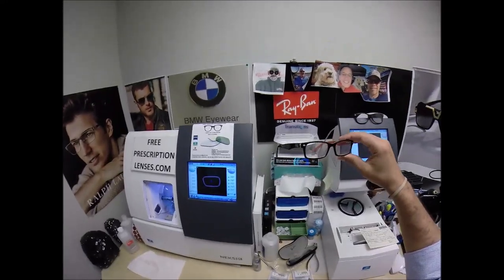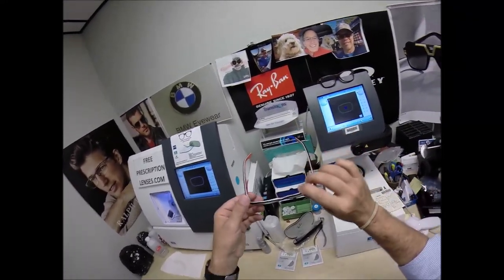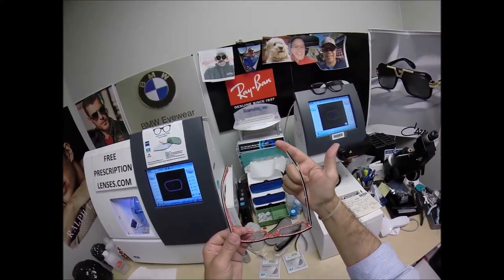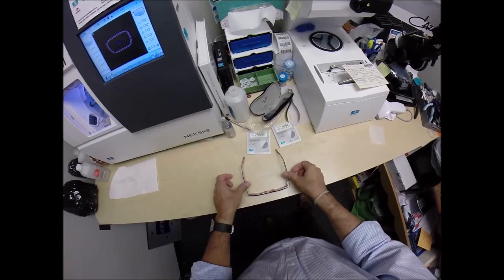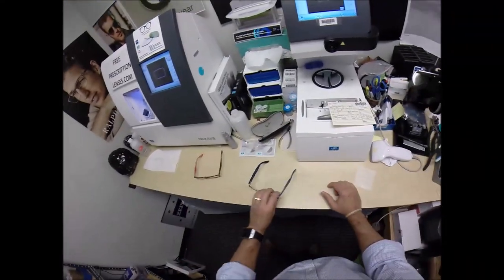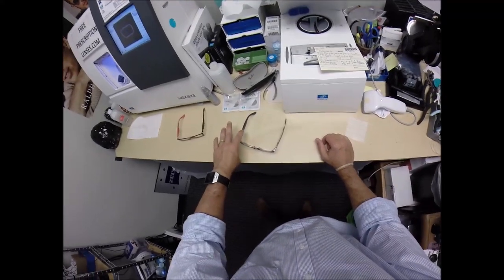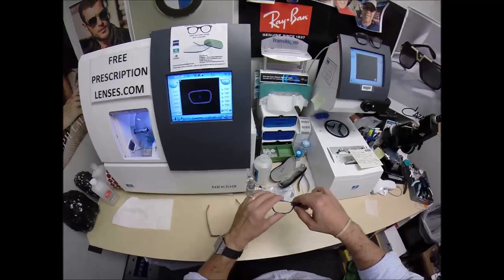And it only takes about 30 seconds to a minute to adjust a pair of glasses perfectly, but I'm going to get them in standard alignment, also known as the three-point stance. The 3 points are 1, 2, and the bottom of the frame being 3. I set them on the counter and press down. There is no wobble. Now, when I say wobble, I'm part of that 80%. When I take my Ray-Bans off and press down, they wobble on the counter, but they sit level on me.